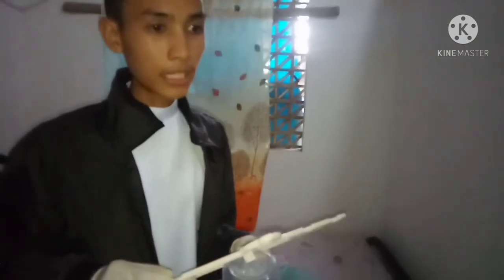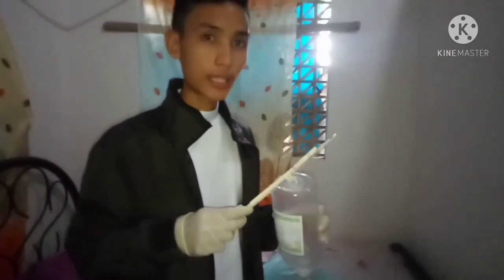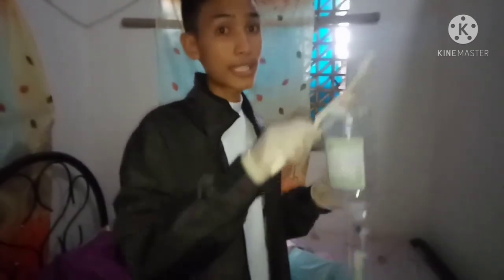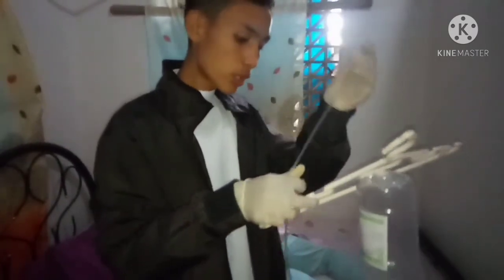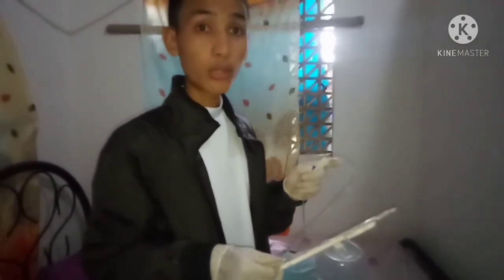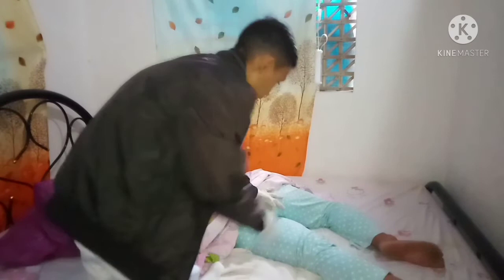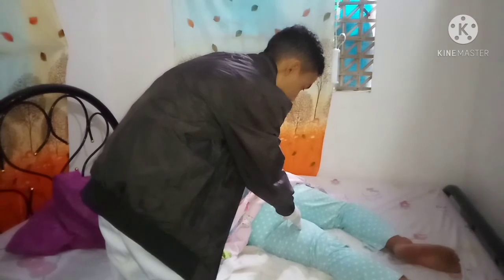Usually in healthcare, we have an IV pole. We need to put it on a high IV pole. So we need to check if the solution is running not too slow or not too fast. If it is too slow, we need to raise it higher. And if it is too fast, we need to lower it. And make sure that we have opened the control so that the solution will go to the colon of the client. And we need to check if there is leakage in the client. So after the procedure is done, we need to assess and tell the client that we are done.